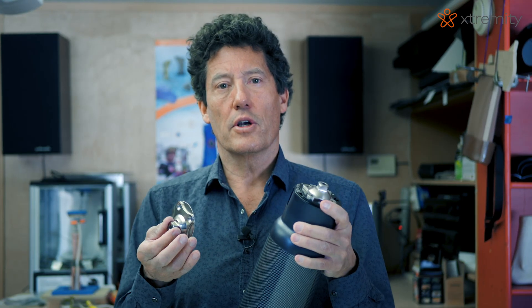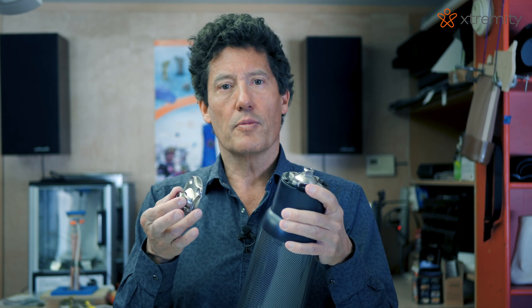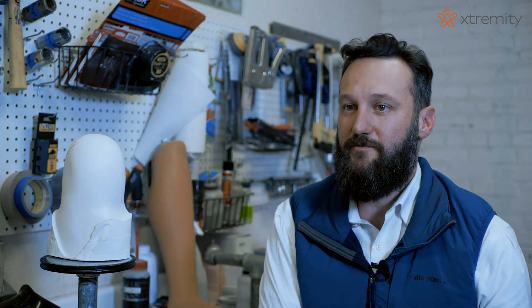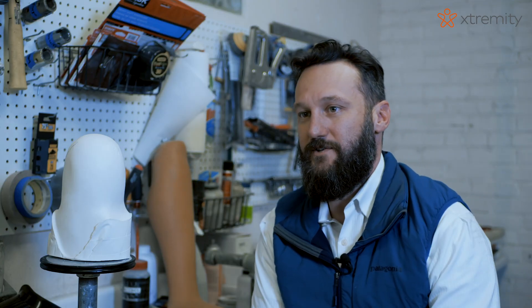One important concept of Extremity products is that the practitioner can use the product in the way they're used to — they don't have to change much. We've just taken the way that prosthetics have been made and improved it.